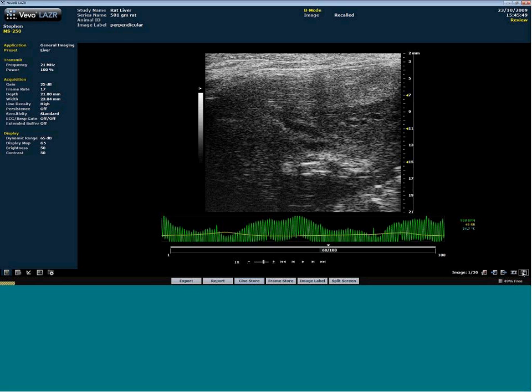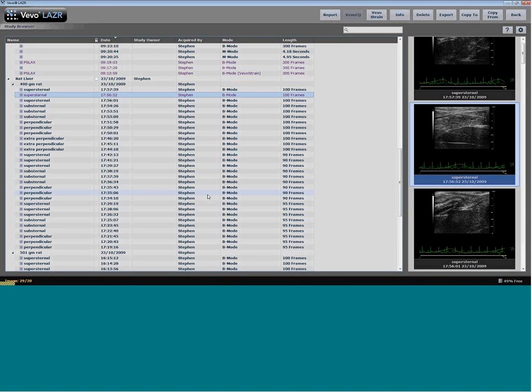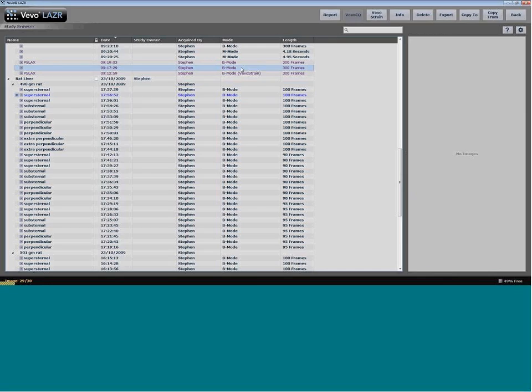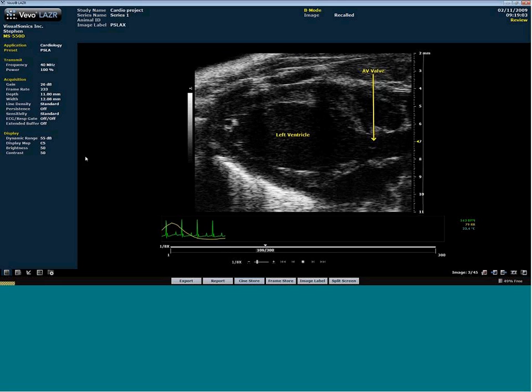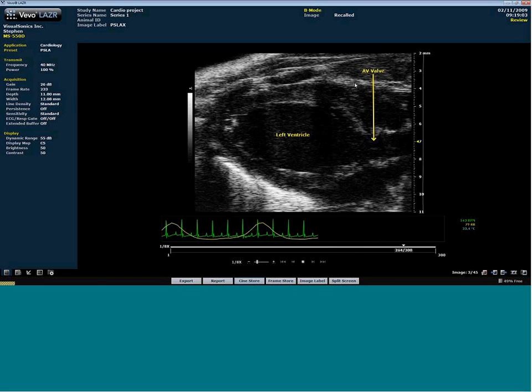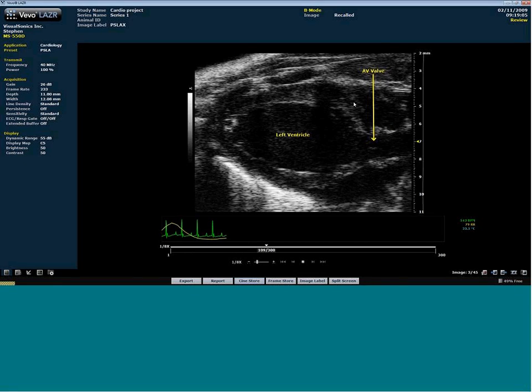I can actually show you here. This is, again, a 250 image, and if we go back to a previous image that I had here, this is also a rat liver image, but this is with the 400, and it doesn't look quite as grainy. And then if we look at the previous B-mode images that we had up here, these are with the 550D. So going up in frequency between these three images, we've gone from 21 to 40 megahertz. It's going to look a lot smoother because the pixel size is a lot smaller. So that's one part of this question.